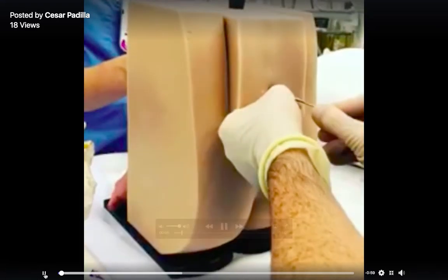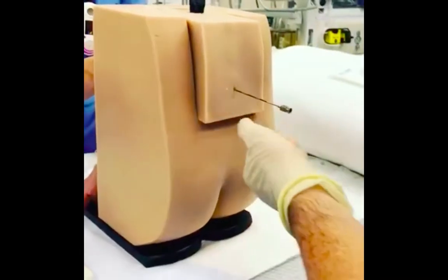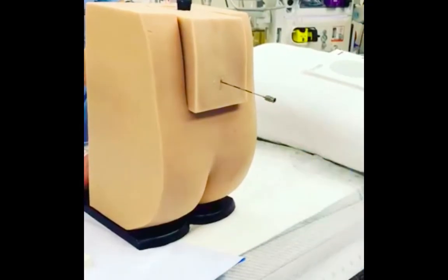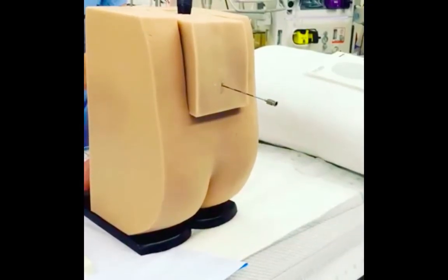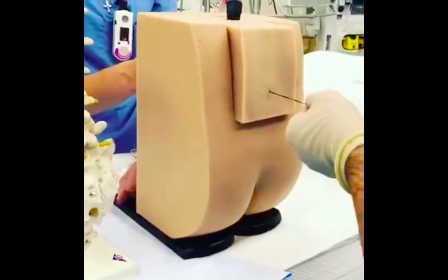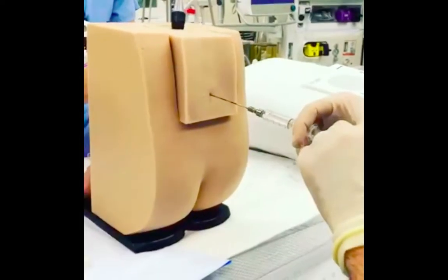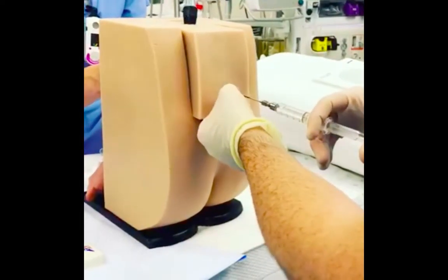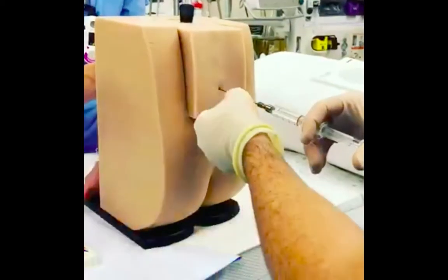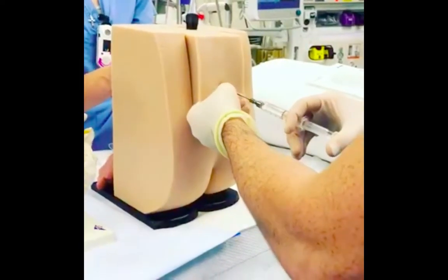You feel some resistance, and that's when you know you have engagement with ligaments. And your needle should look like this. Otherwise, it would be too floppy and you're probably too superficial. Now, you want to use saline in your syringe. You make a nice lock, and about 50% of the pressure is going to be on your hand here, and about 50% as you're advancing. And what you want to do is advance until you have a nice loss of resistance, which is indicative of being in the epidural space as you pop through the ligaments.